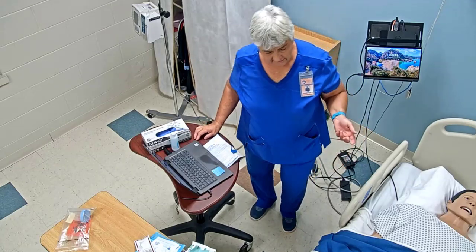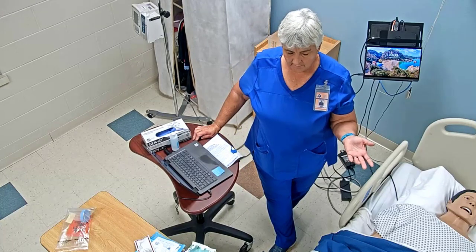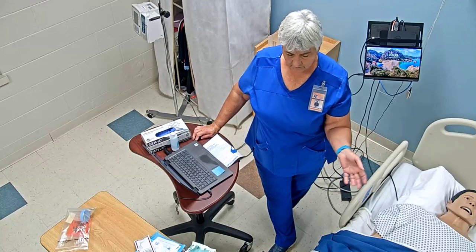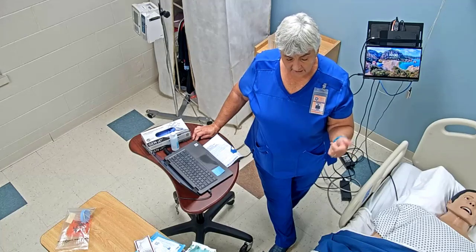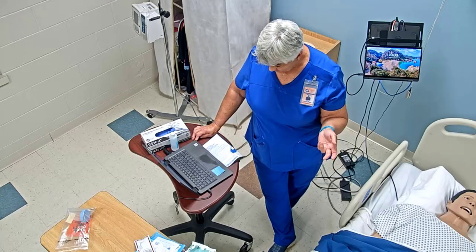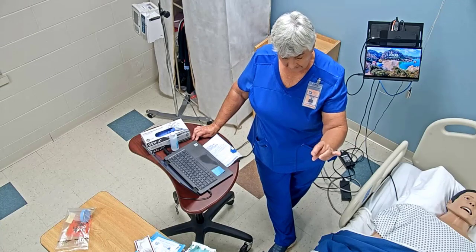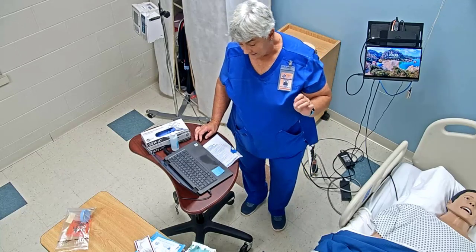If we found anything that was abnormal, which would be unexpected, the expected would be that we were able to drain and we got the urine out, the patient has comfort, and we'll send that off for the lab or the UA. But anything abnormal, we're going to document, we're going to report to our healthcare team, which includes the physician. And then documenting, like I said, it's going to be date and time stamped when you click on it.